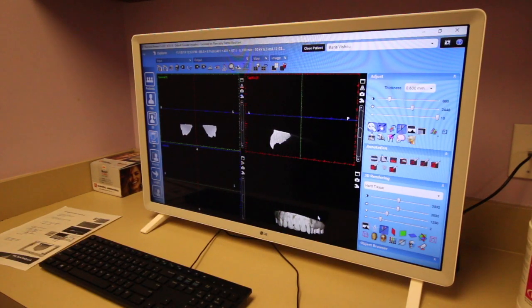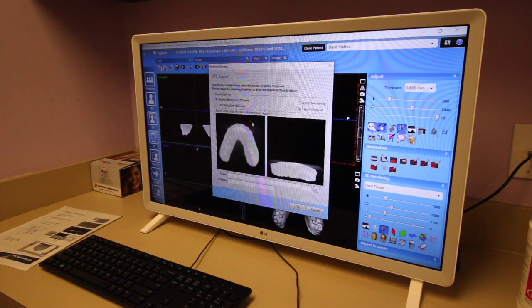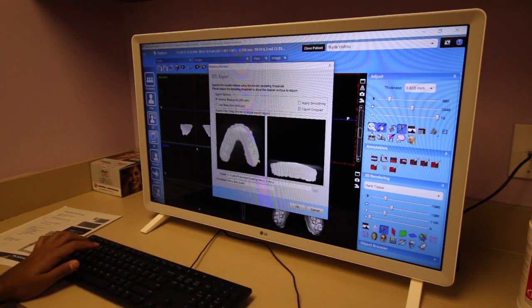So now that we took our scan of the upper model, we are now going to export it as an STL file so we can use it in Mesh Mixer to form the bite guard. We're going to go over here to File, scroll down to Export, and then Export Volume as STL. And you can save it in a folder that you made for the patient. So I'm going to save it to the folder here. And save.